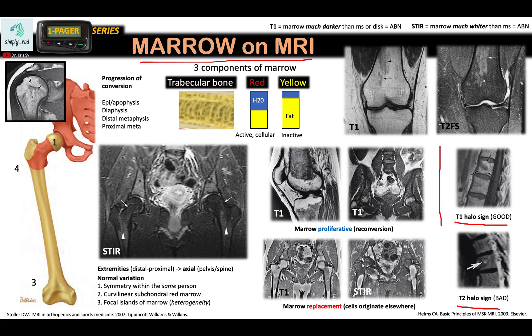In the T1 halo sign, what we see is a low signal lesion surrounded by a hyper-intense signal in its periphery. Since this is a T1 study, this hyper-intense signal surrounding the hypo-intense lesion is considered as a fatty replacement. If fatty marrow replaces your previous area of hypo-intense lesion, then it's a good sign — it means this lesion is responding to treatment.